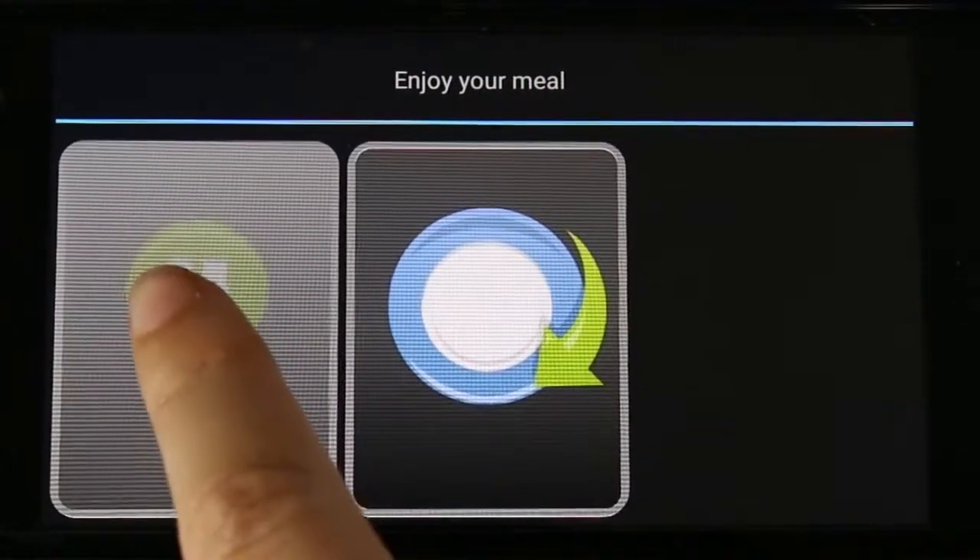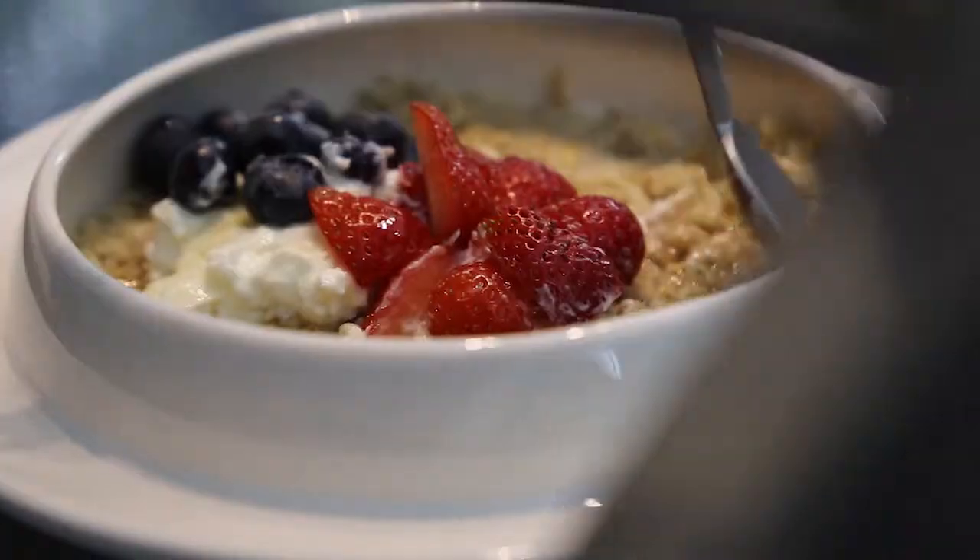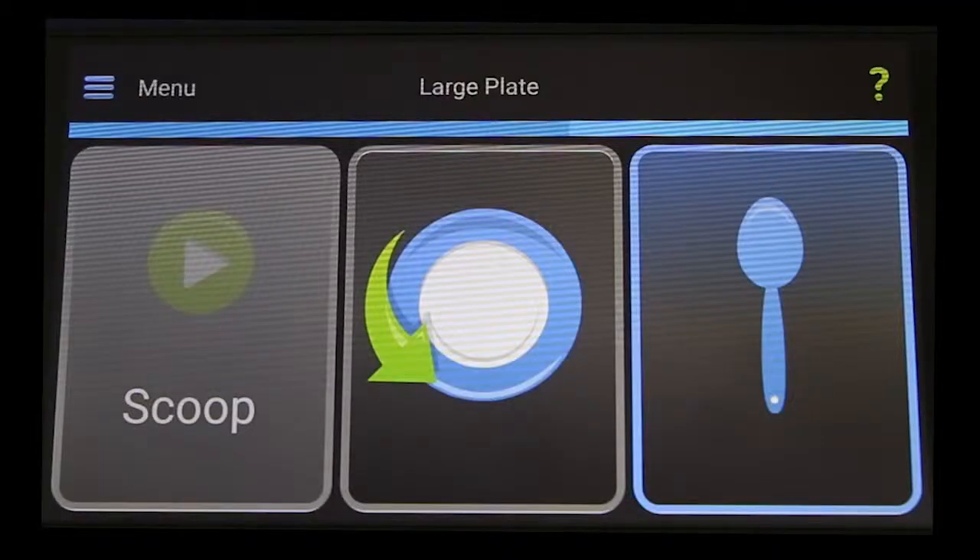The left button is used to play and pause the movement of the spoon. You can see here it is grey — it has been set up so that the user has to wait before pressing it again, to ensure enough time for chewing and swallowing.